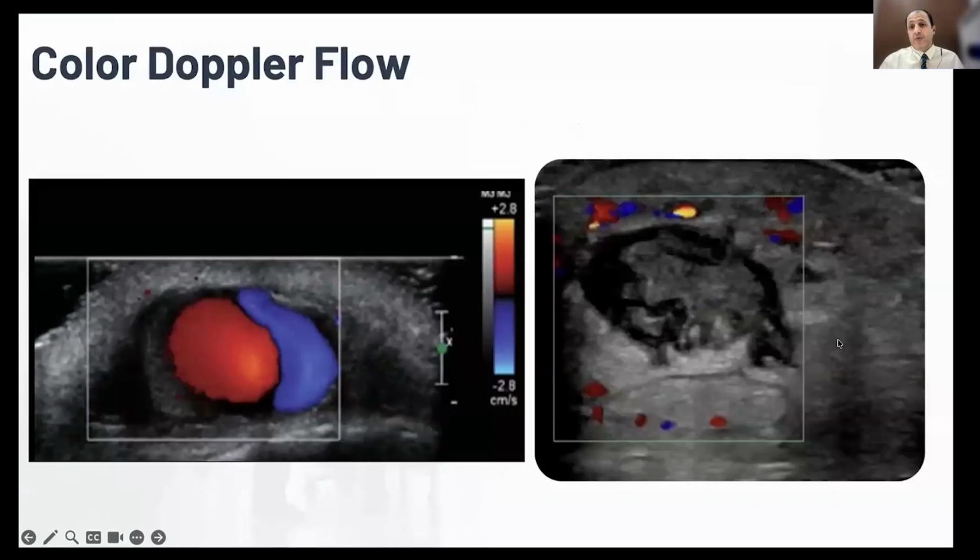One reason is just to see whether there is inflammation or not, but that is not the main aim. We want to use the color Doppler to map adjacent structures, or to characterize the lesion that we find, for example, a pseudoaneurysm. Here it is a case of an IV drug user who came with redness over the groin, and then they found a pseudoaneurysm with color Doppler. If you don't do the color Doppler, you may go for aspiration and end up with a worse outcome for the patient.